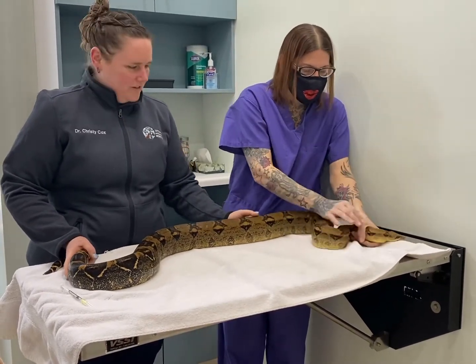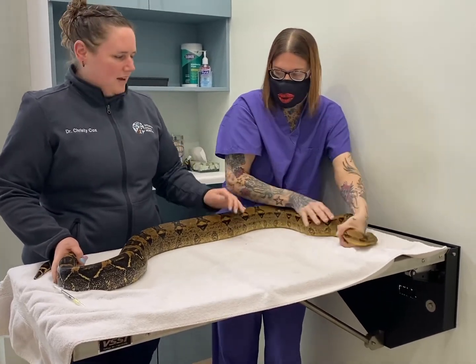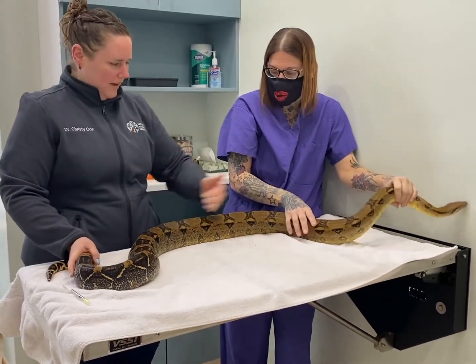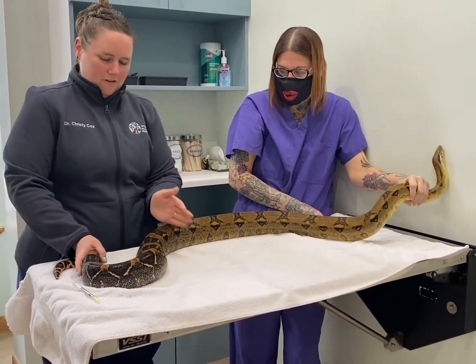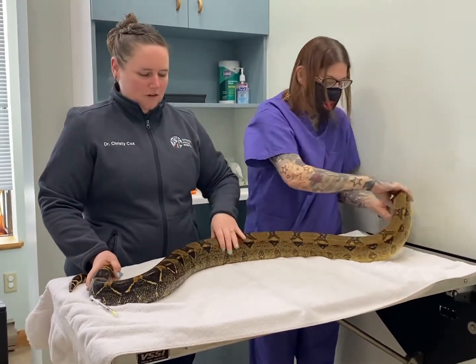Jafar is our volunteer of the day. Typically what we do is we want to separate the snake into kind of rough thirds. So if his head's up here and his tail's down there, you just visualize the first third, the second third, and then the third third. You want to be in that middle third when you give the injections.